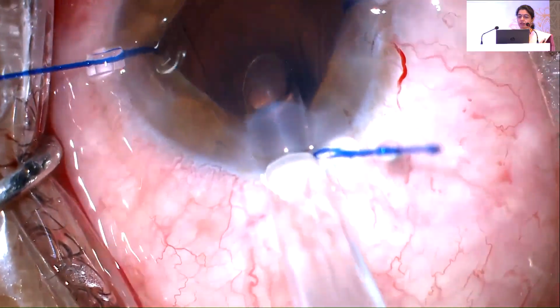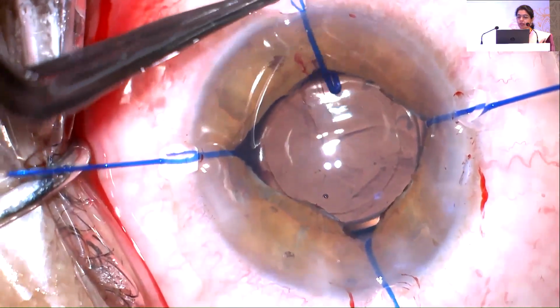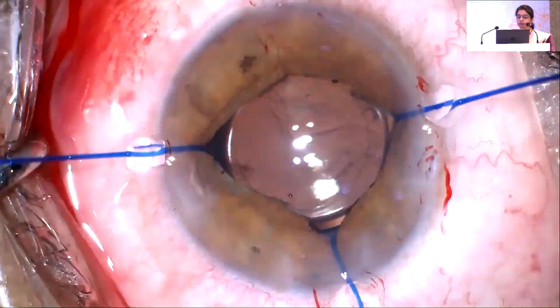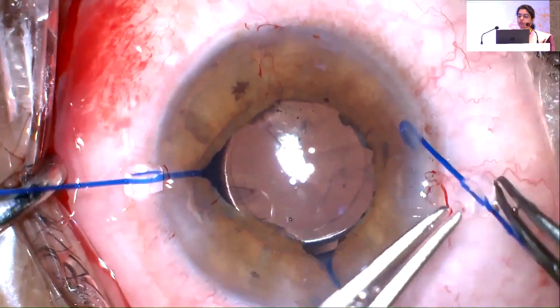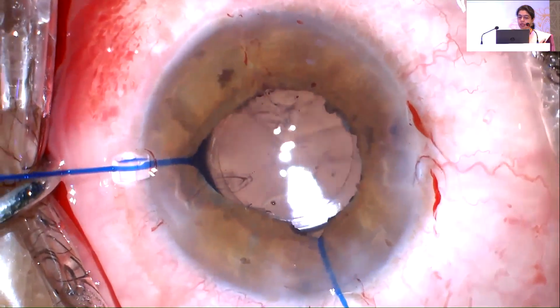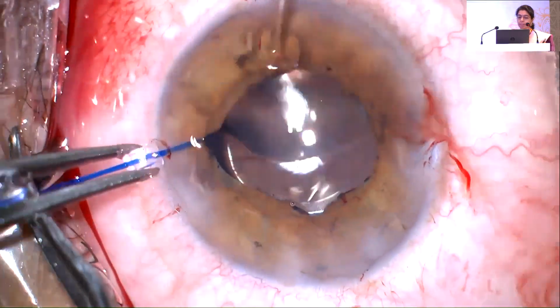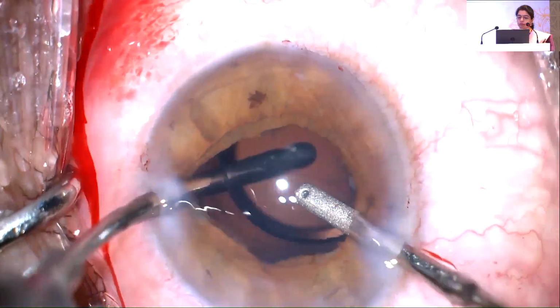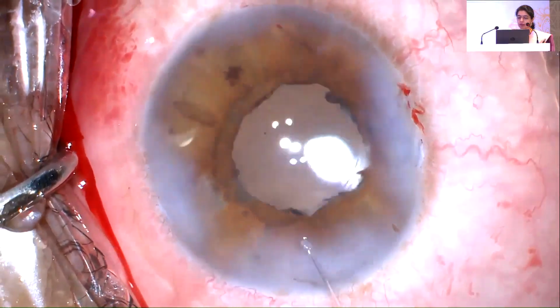Phacoemulsification is not very difficult in these eyes. Removing the iris hooks is also very straightforward. While removing the viscoelastic, please take care to remove the viscoelastic even from behind the IOL, because retained viscoelastic can cause further inflammation in these eyes. So, removing the viscoelastic thoroughly from the bag and closing the case.